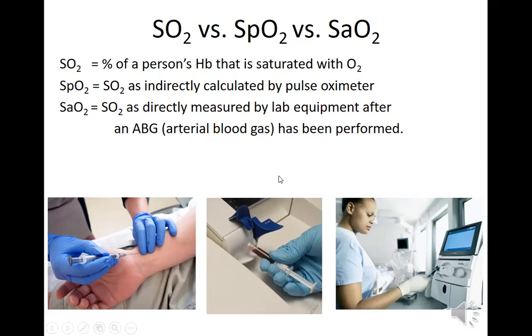So before we mentioned the positive things about using the pulse oximeter you put on your finger, SpO2, is that you can monitor a person constantly with their pulse and then their SpO2, which is the saturation of hemoglobin with oxygen. But the problem with the SpO2 is that it's absorbing other gases at the same wavelength, which I'll show you.